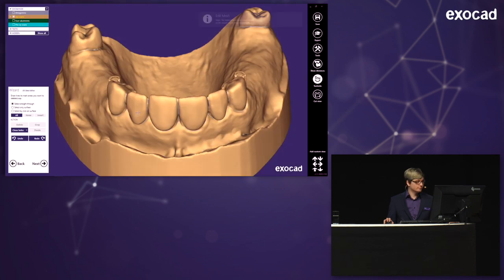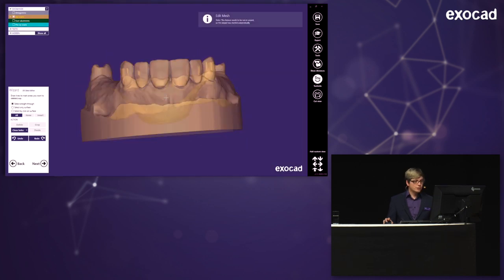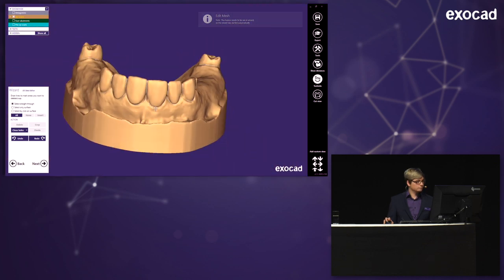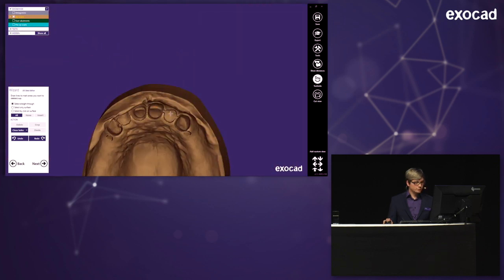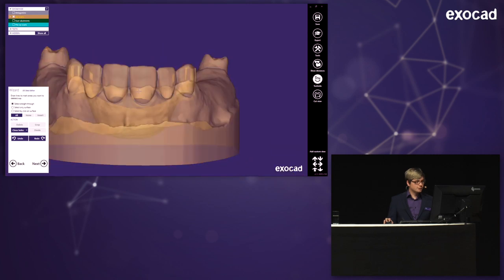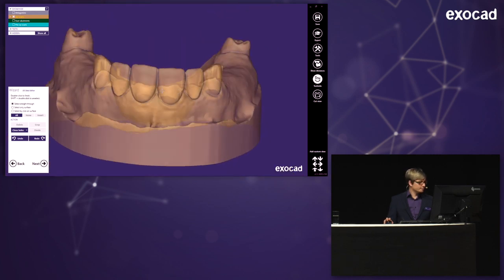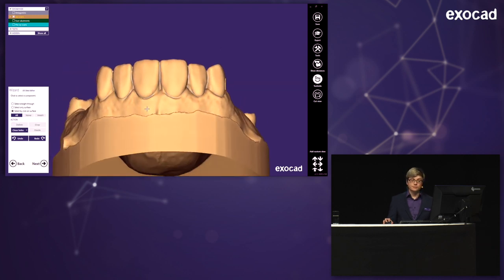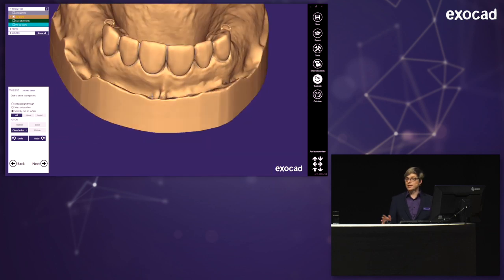I'm choosing the first one. And the easiest way, because I have several parts floating inside of here, like you see here, bit hard to see, is just selecting by click on surface and crop it. And now everything that's not connected to this mesh is gone. And you could use it for anything else, for printing or whatever.